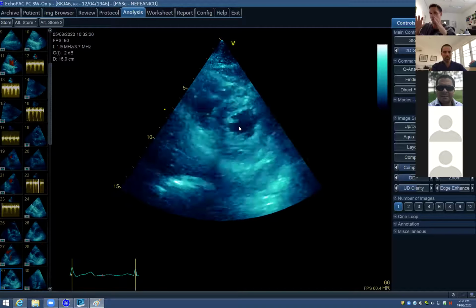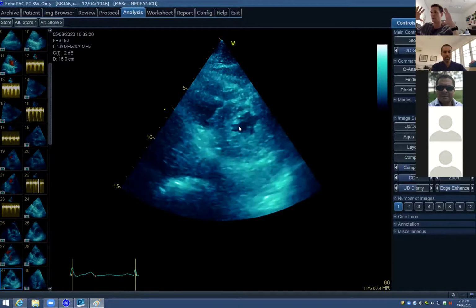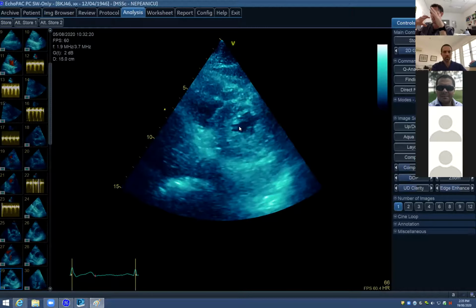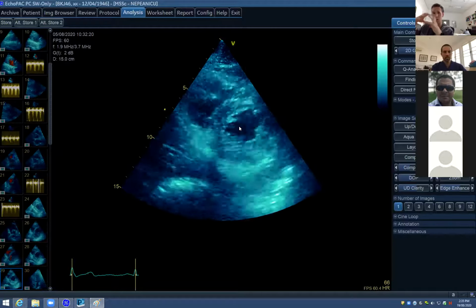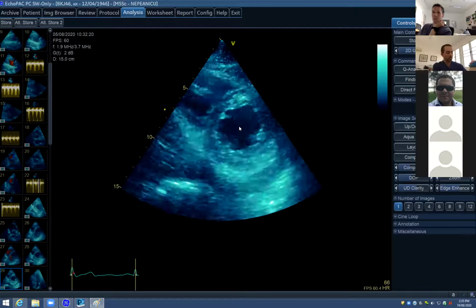And then using my peripheral vision, I look at the septum. Obviously systole is when the ventricle is coming towards the center of the heart. That's where I'm looking, and I can see where the septal bounce is. Does it happen during the contraction, or does it happen with the relaxation? That's something I just find useful.